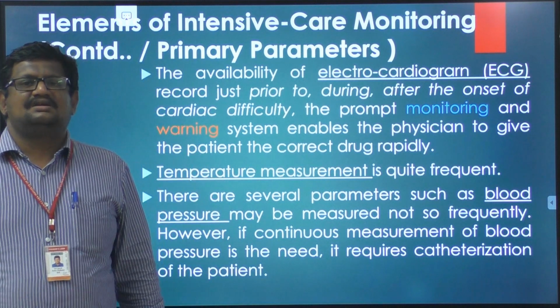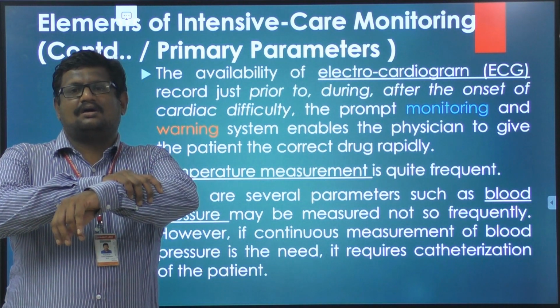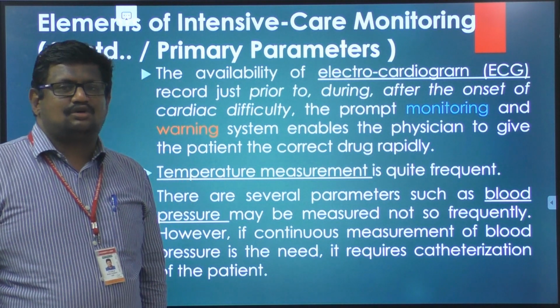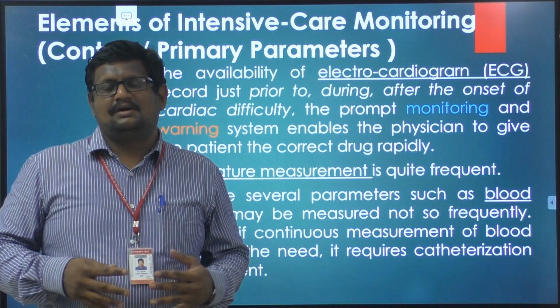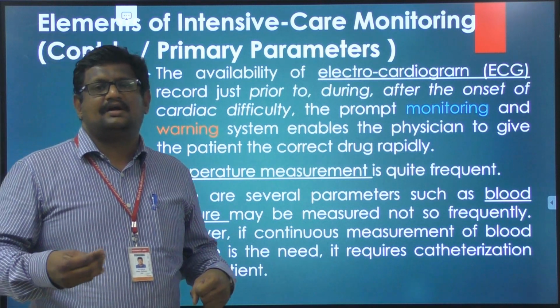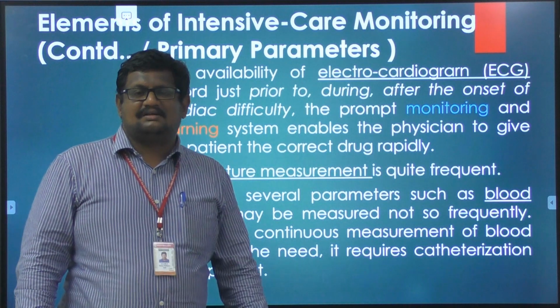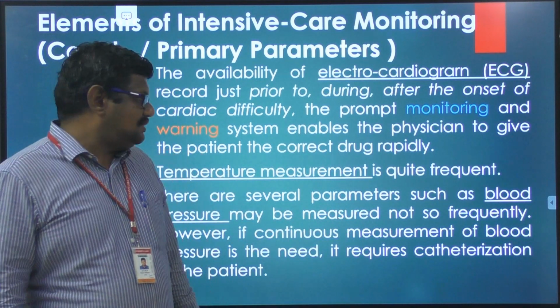Whatever we discussed in unit 3 was indirect blood pressure measurement, where a cuff is placed over the human arm and is inflated and deflated to hear the systolic and diastolic pressure. That is an indirect measurement without disturbing the human body. That is non-invasive. Non-invasive in biomedical terms means you are not disturbing or invading the human body, whereas invasive measurements are those where you are invading the human body.